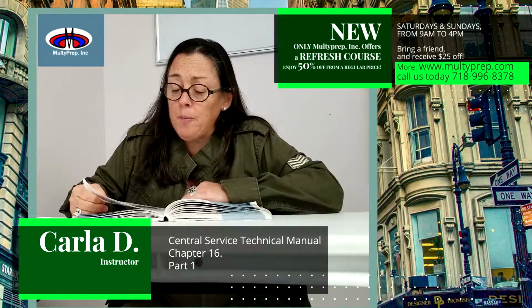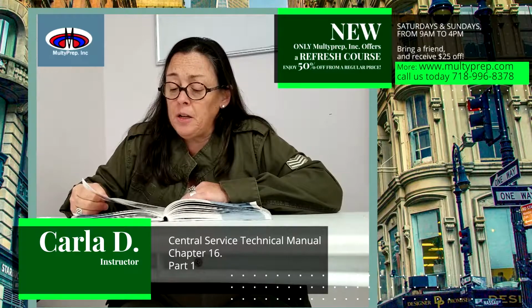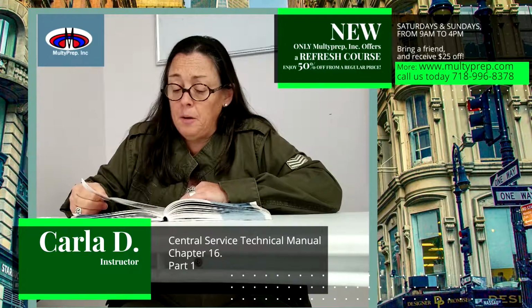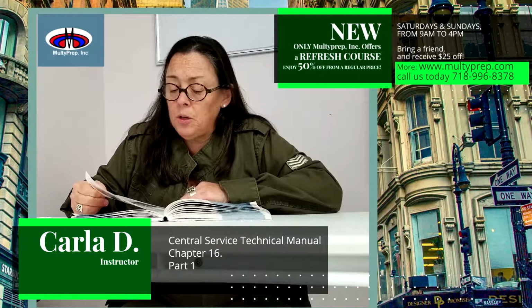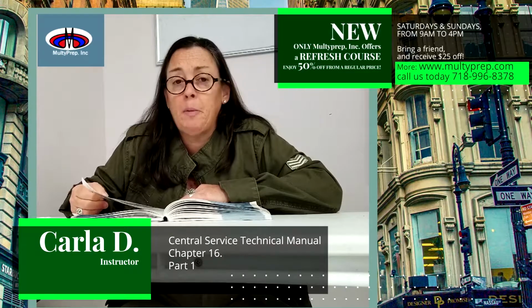Once items are properly cooled, they may be placed on the storage shelf. Carefully check each item prior to placing it on the shelf. Ensure the indicator tape, peel package seal, or container locks are intact. Physical chemical indicators, CIs, should show appropriate color change. There should be no holes or tearing in the package material.